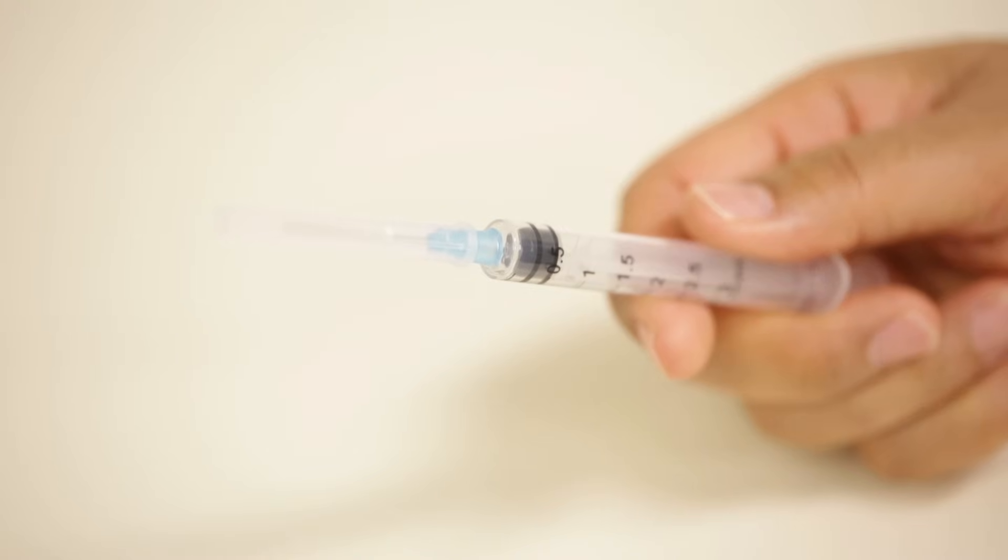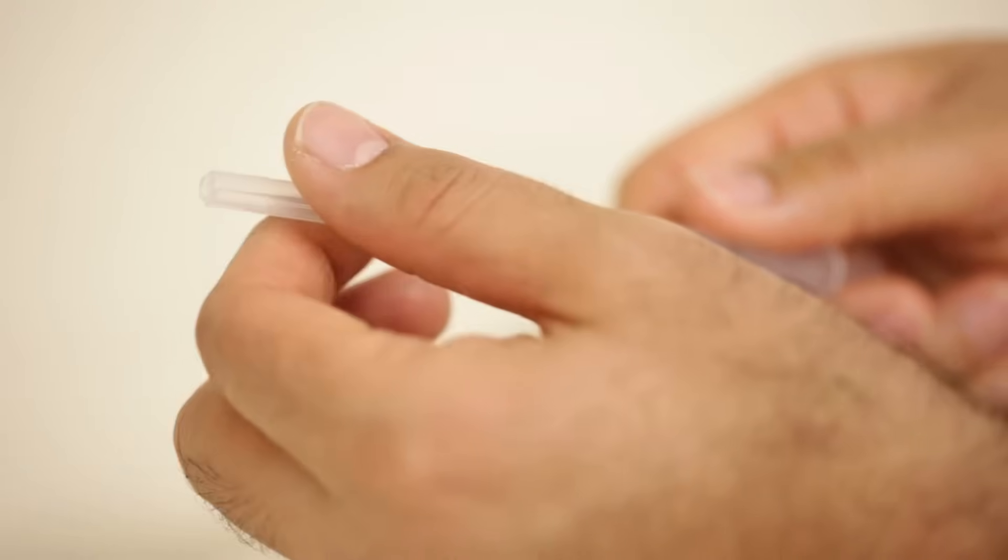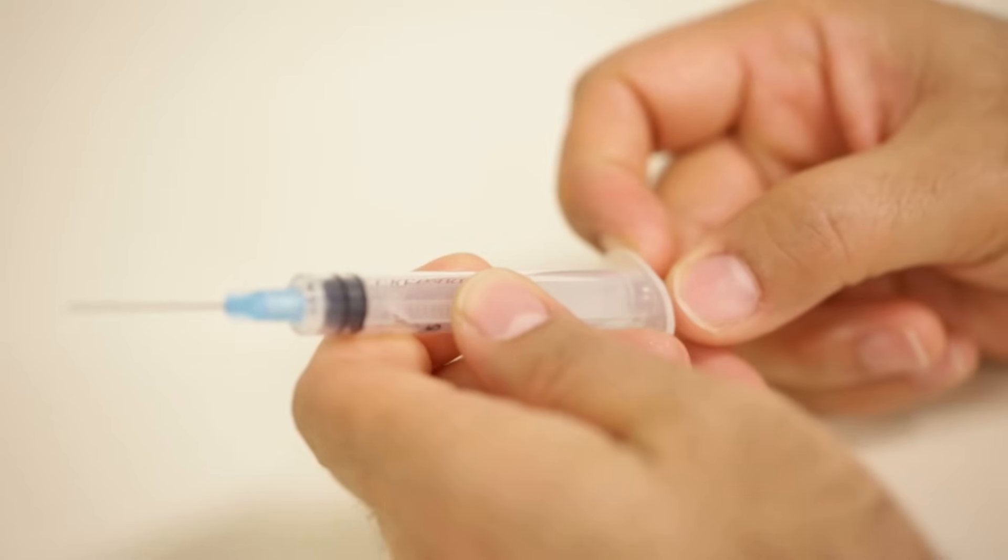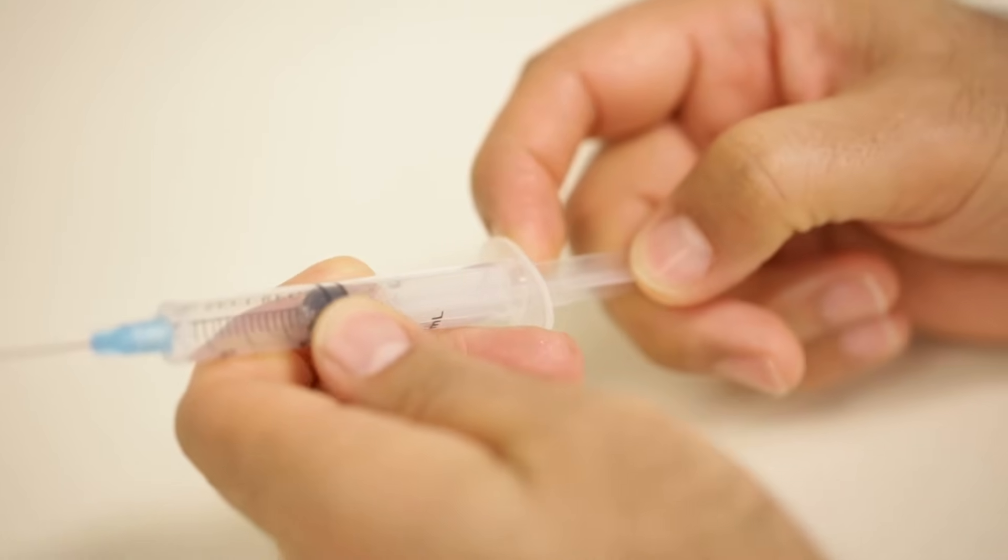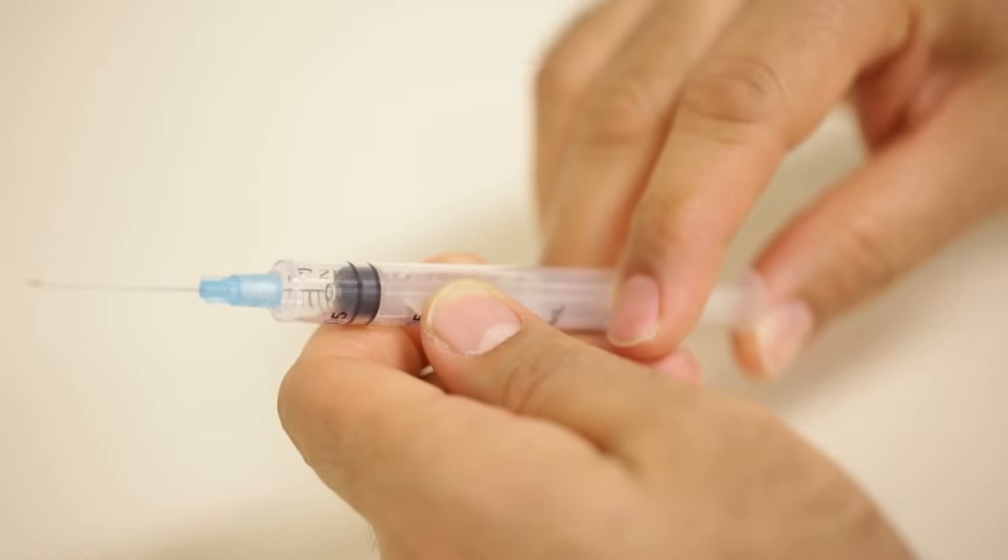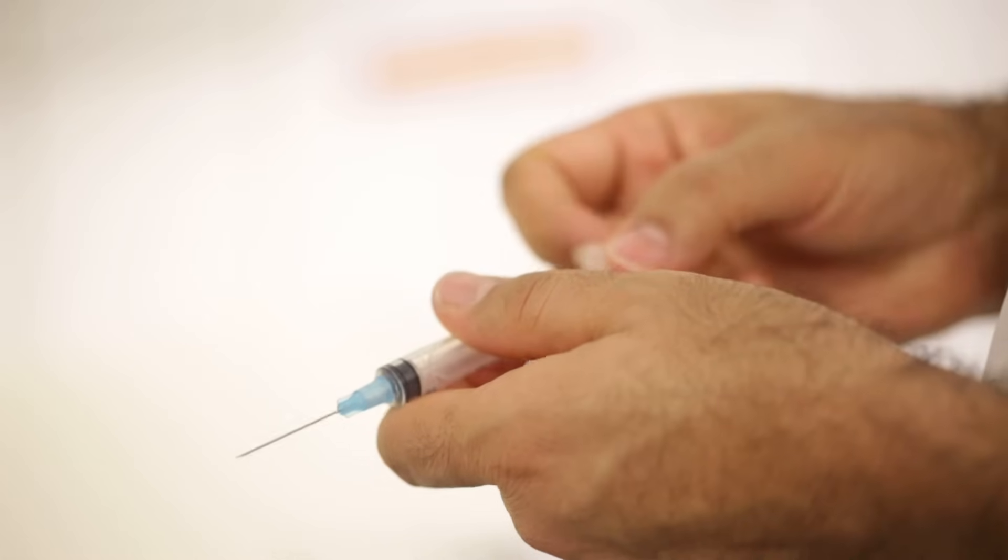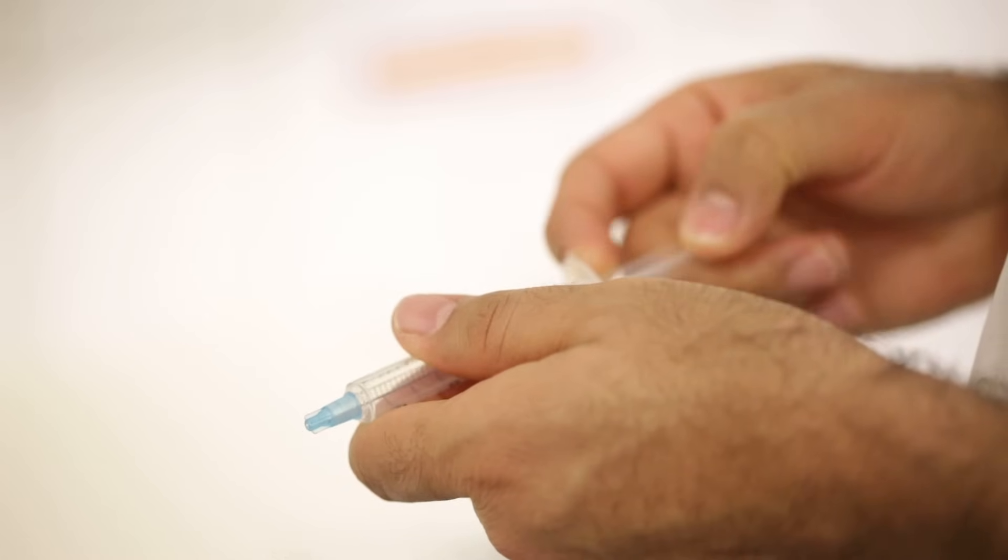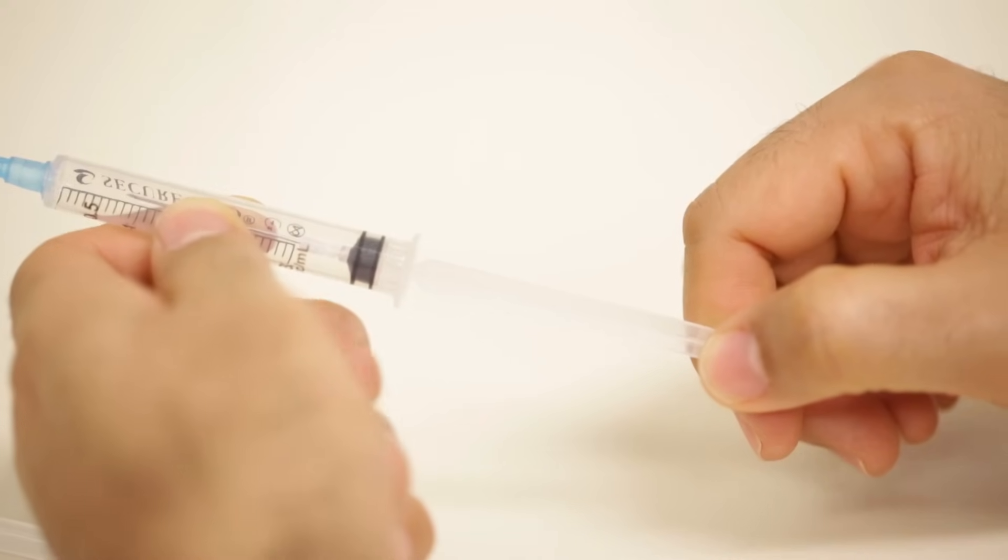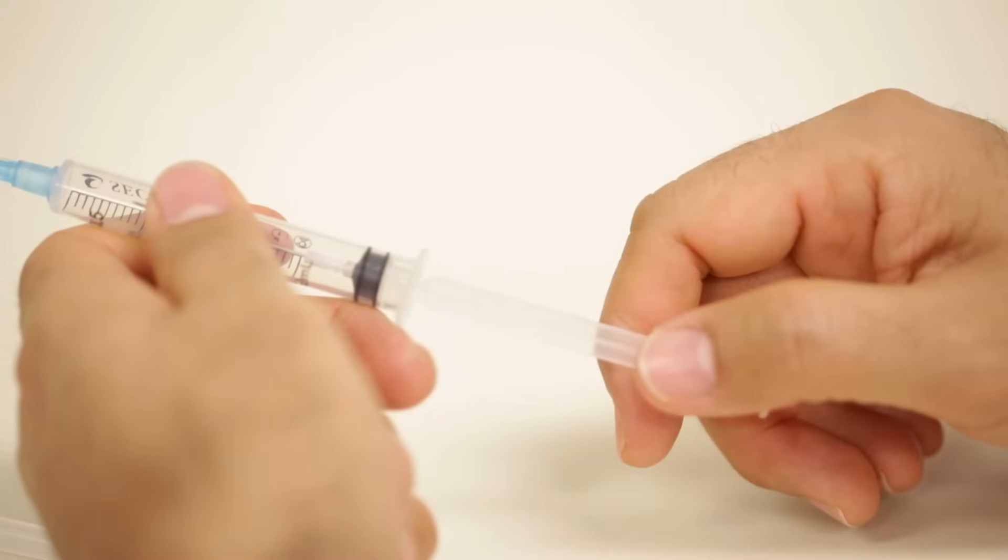This syringe has reuse prevention and sharps injury protection features. After the injection, push the plunger forward until you hear a click, then pull back to retract the needle inside the barrel. Continue to pull, applying force to break the plunger.